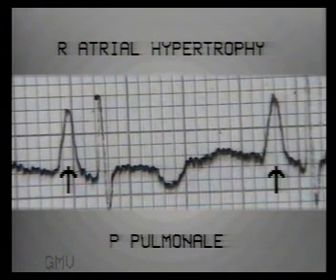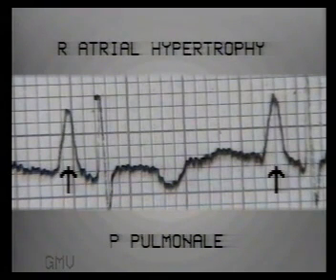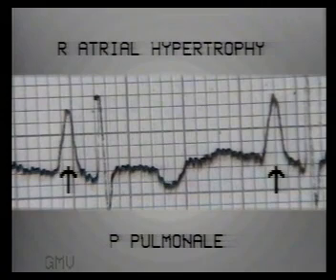This is a very prominent P pulmonale — 5 small squares tall — suggesting right atrial hypertrophy.